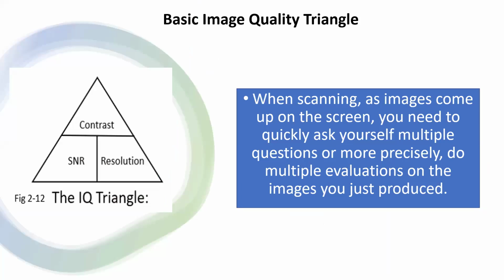So we're going to cover image quality here a little bit. I'm going to go through some image quality things, what to look for, what makes a good image, what makes a bad image. So when you're scanning, and your images come up on the screen, you need to ask yourself, is this a good image? Does it have the right contrast? Does it have good signal to noise? Does it have resolution? And the rads will call you out on that. You guys have been in clinical for a while, or maybe you've done a decent amount of scanning. Radiologists love to, okay?